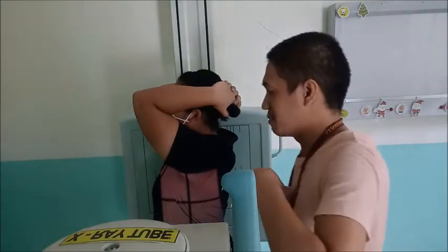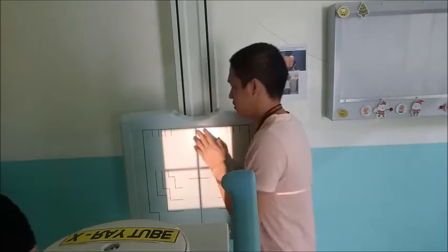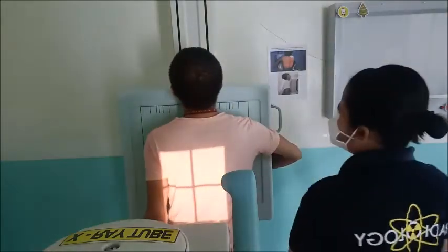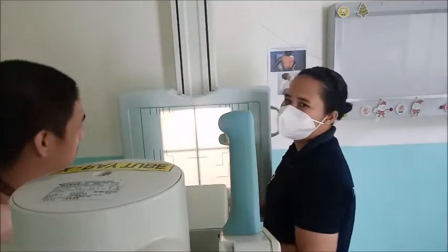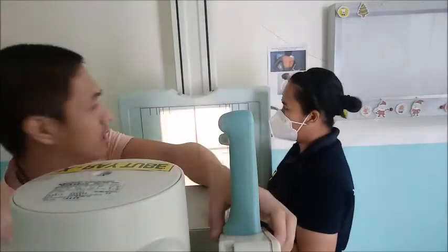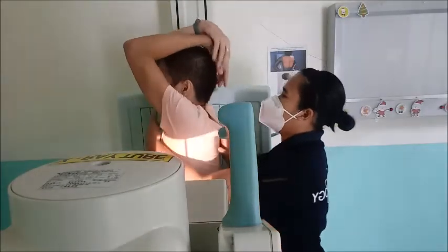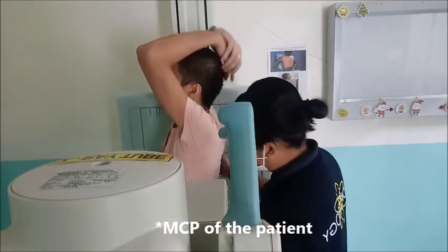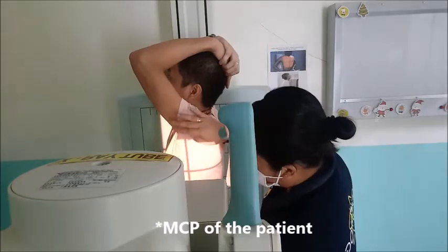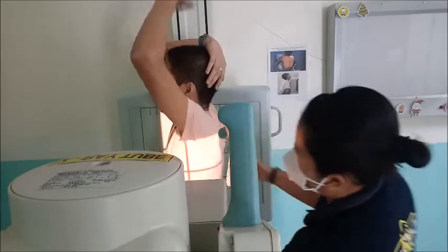So again, the MSP of the patient should be also the center of your crosshair, and then center of the vertical na ito.